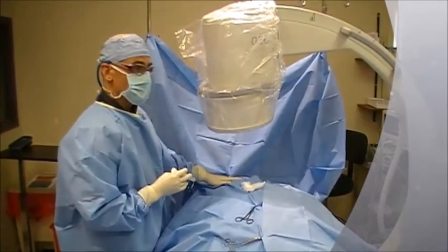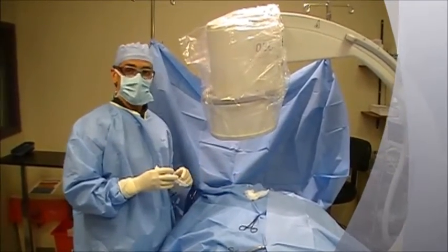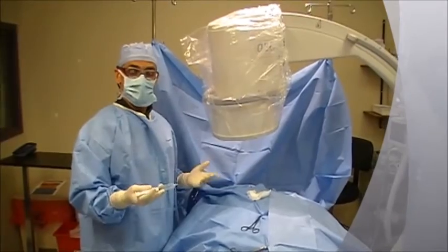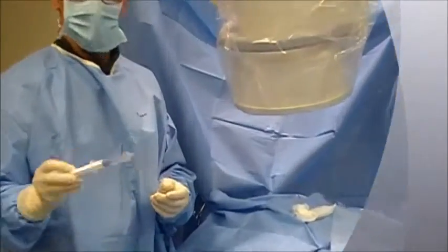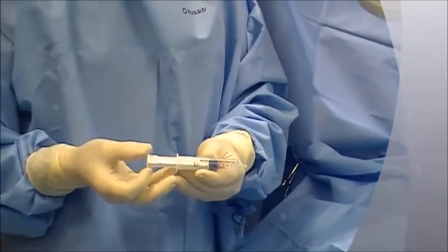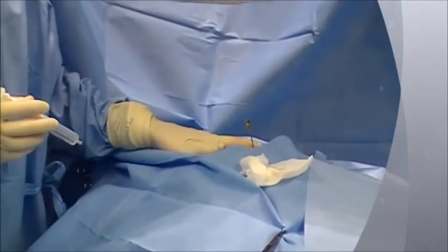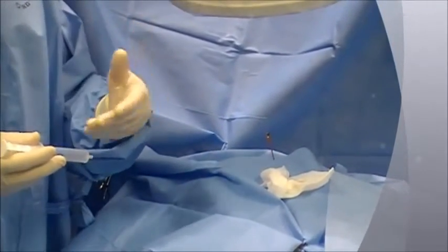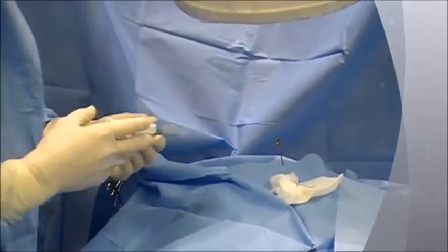I've placed the Tuohy needle into the dorsal aspect of the spine, just about entering the epidural space. The way we can determine that we've entered the epidural space is with a technique called loss of resistance. In this case we use air with a special syringe called a loss of resistance pulsator syringe. We gently advance the needle, and once we enter the epidural space the surgeon can feel a palpable loss of resistance to injection.